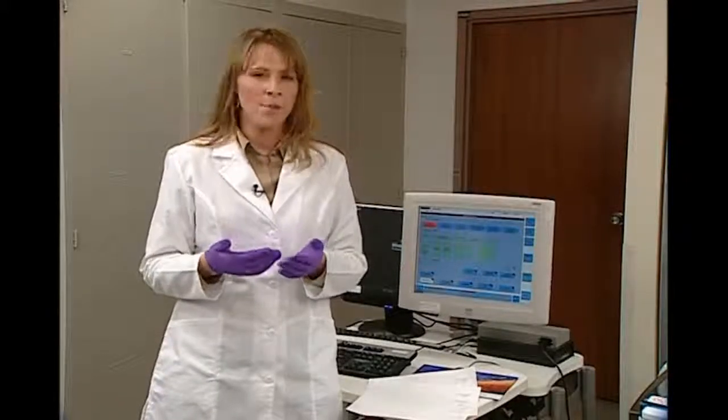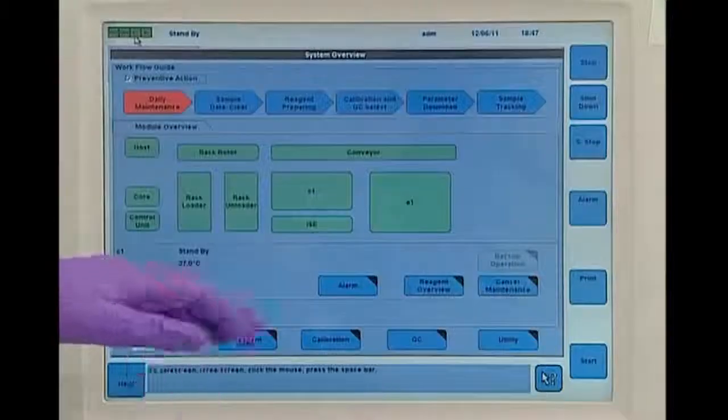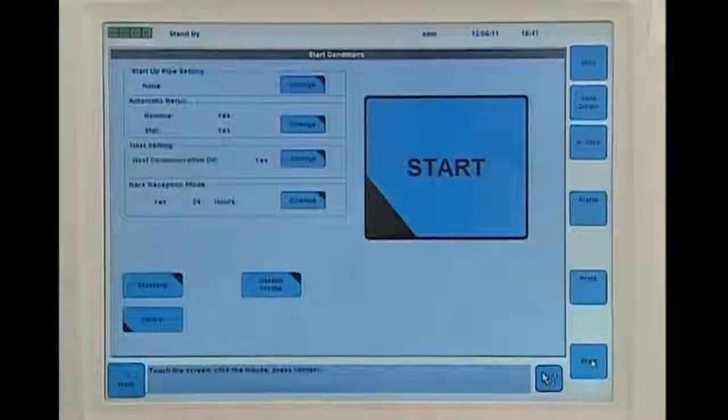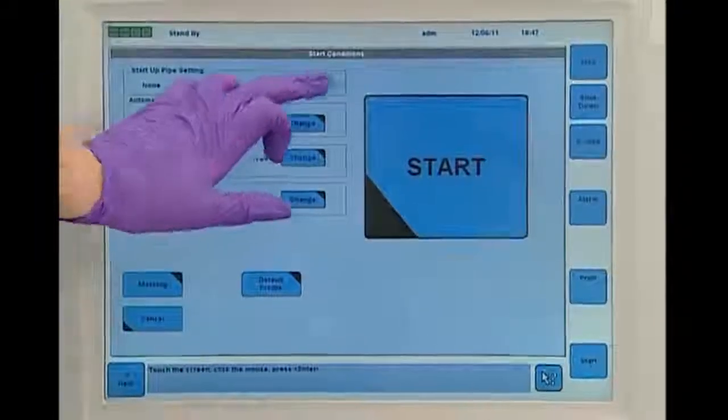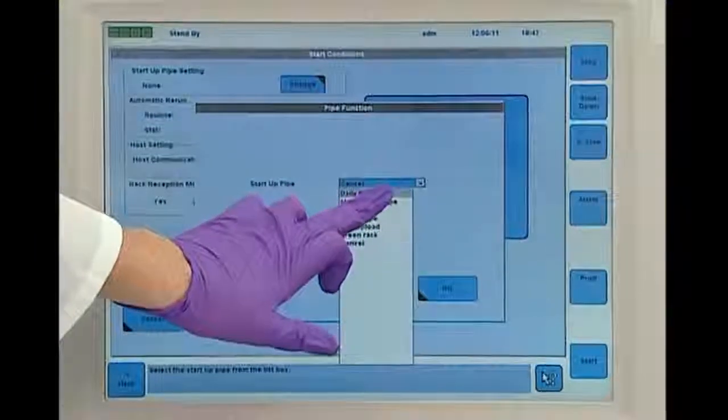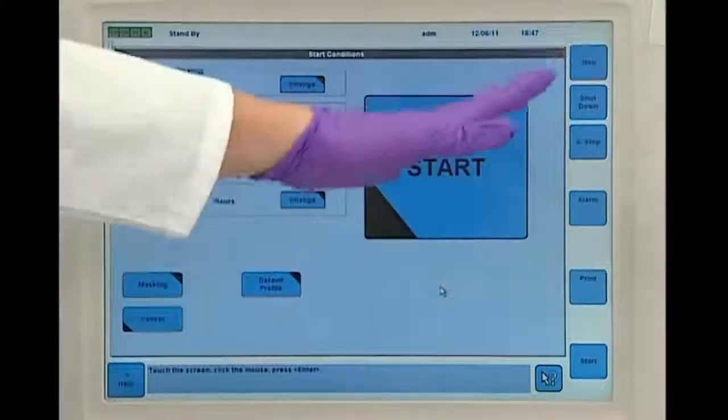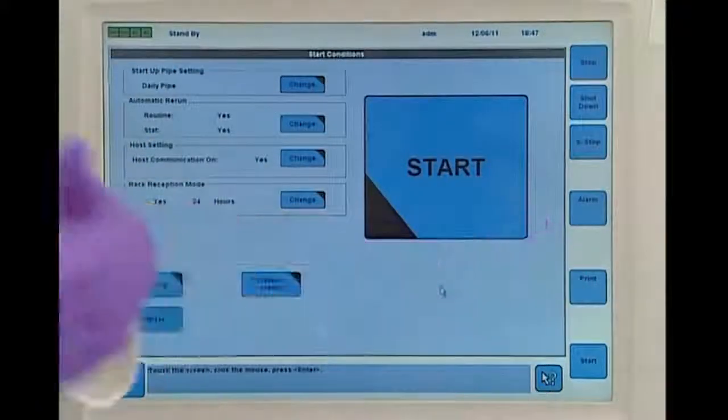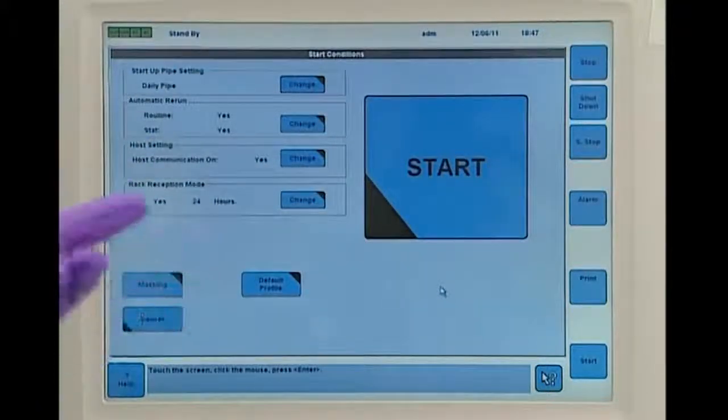Those items might include photometer check, incubation bath exchange, and an air purge. The daily pipe is very easy to access. We're just going to go to the start condition screen, and we're going to select the daily pipe and say OK, and then hit the start button. The daily pipe will immediately start processing, and I can now go to load the cal set controls.